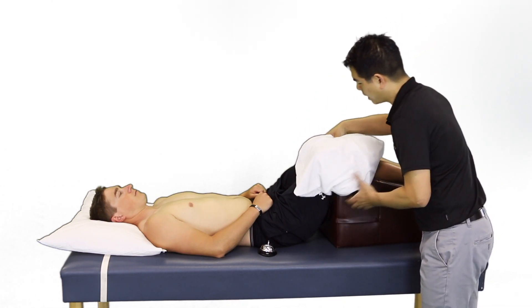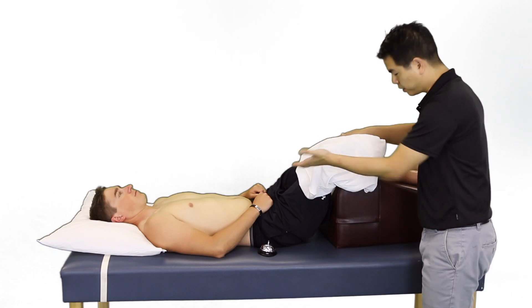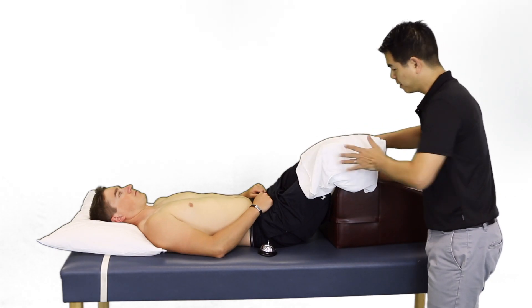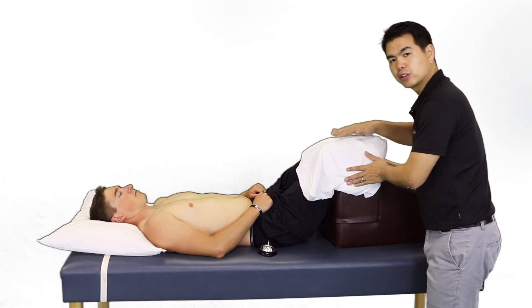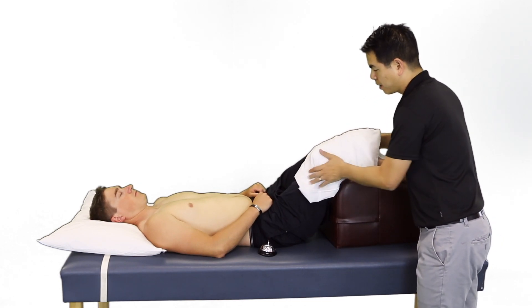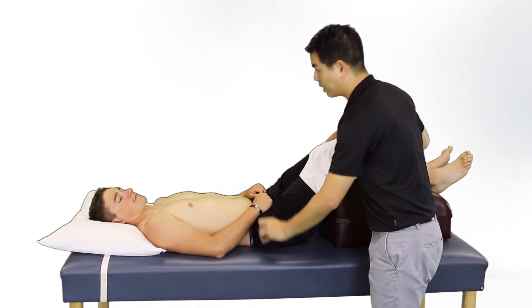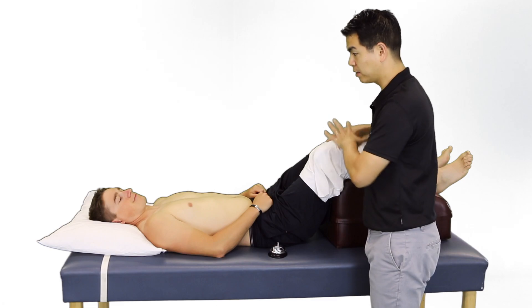I'm going to apply the ice pack over the knee. If the limb is edematous or swollen, ensure that the limb is elevated. Make sure that there's good contact between the gel pack and the skin. Tuck it in nicely and securely. Ensure that the patient knows there's always a bell here that you can use to get my attention if there's any problems.